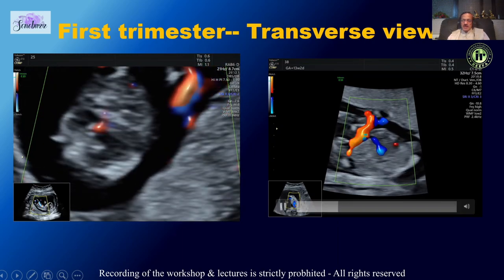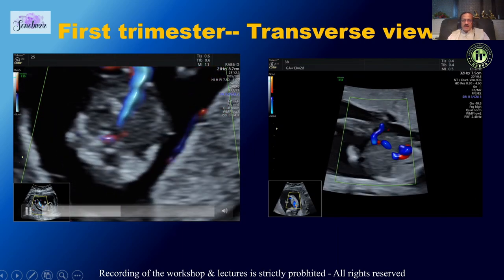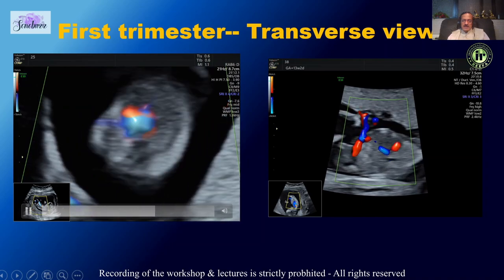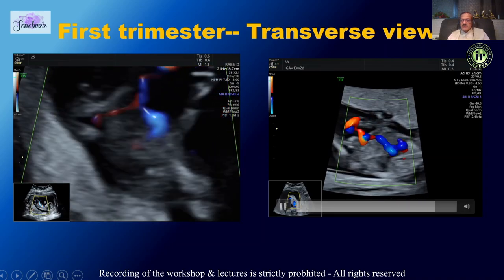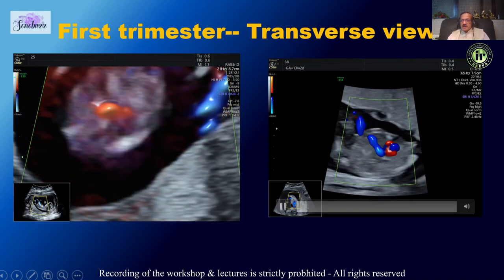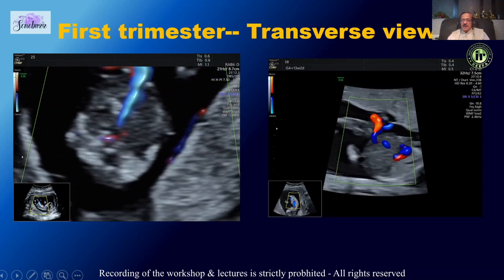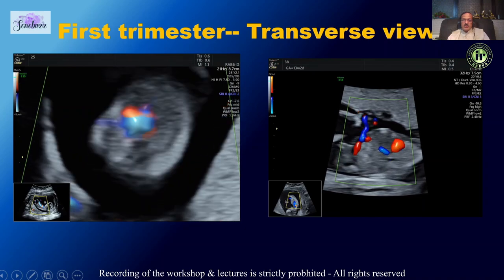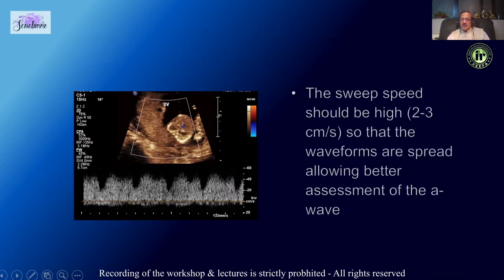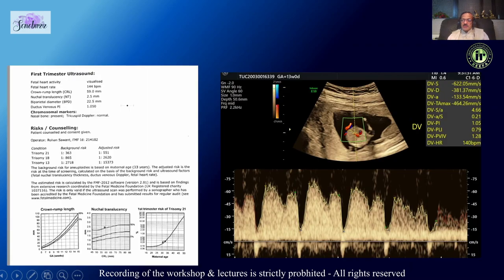Here in the transverse plane with an NT scan, that is the umbilical vein and that is the ductus. You can see aliasing — a lighter shade of color — telling you that is the point to sample. Make sure your sweep speed is high so you can spread out the waveform and differentiate between the S wave, D wave, and A wave.